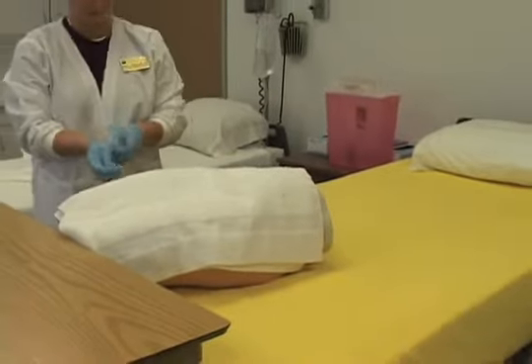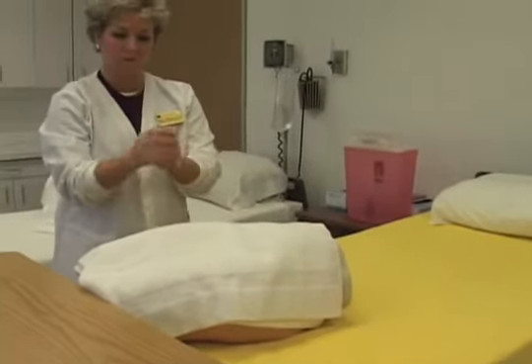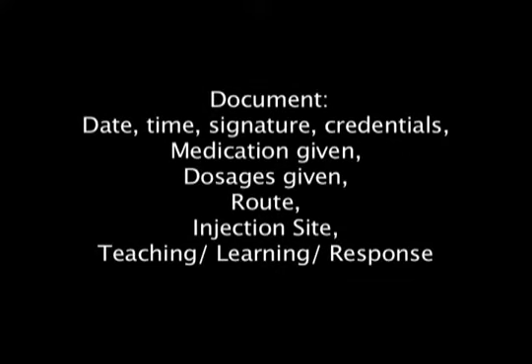Perform hand hygiene and document. Documentation would include date, time, signature, credentials, medications given, dosages given, route, injection site, and teaching learning response.